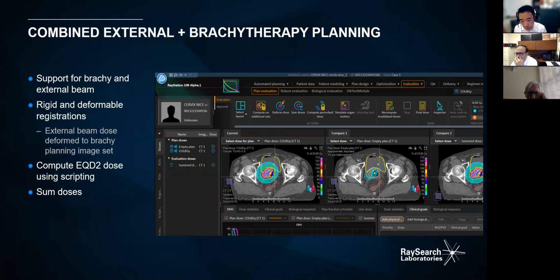Hi, this is Freddie Cardell. RayStation has a few algorithms. One of them is called Anaconda, which is developed by RaySearch. It's our own algorithm. We also have Morpheus, which was developed with Princess Margaret Hospital, and that deals with sliding surface deformations as well. If you're interested in the algorithms that we use, we can certainly send you more information afterwards if that's helpful. Yes, if you can, after this meeting, share any literature on the deformable image registration and which algorithm it is based upon, that will be beneficial.